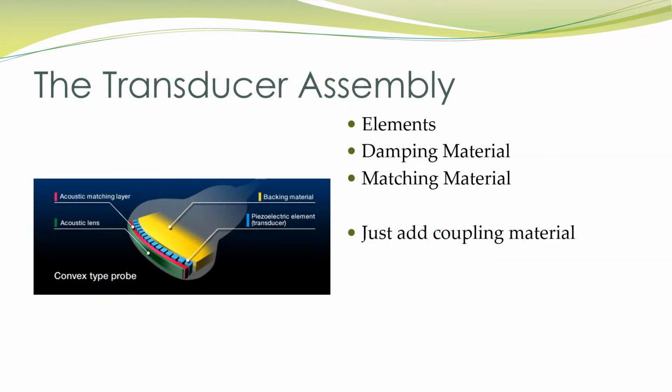Now, the transducer assembly, so the piezoelectric element that we've been talking about, is represented here in the blue. And I'm going to briefly discuss this because it's not something you're going to be utilizing a lot. But one of the things that's important to recognize about our transducer assembly is that behind the row of elements that you see here, we have something called a backing material.